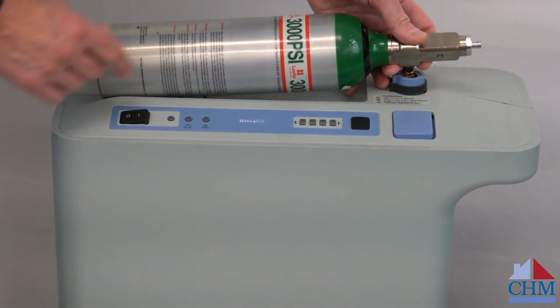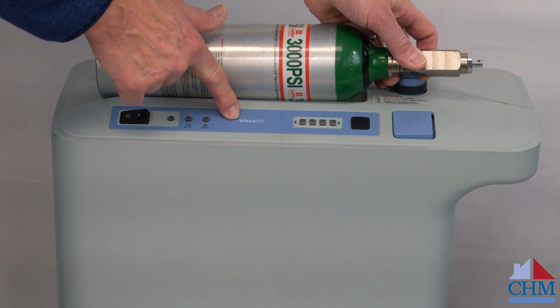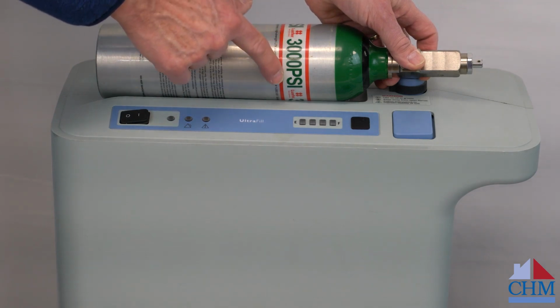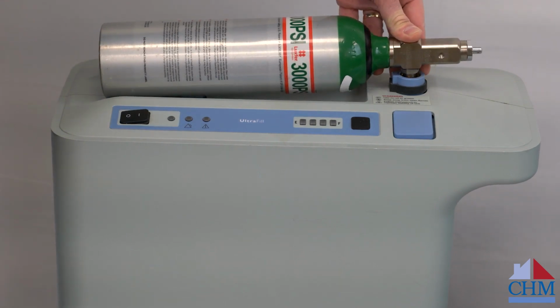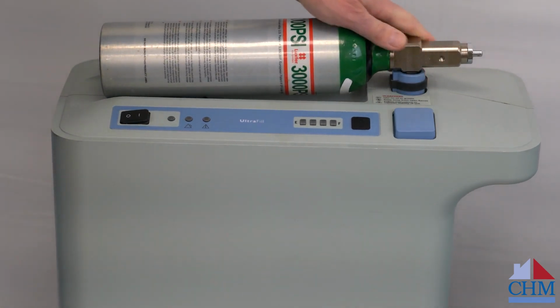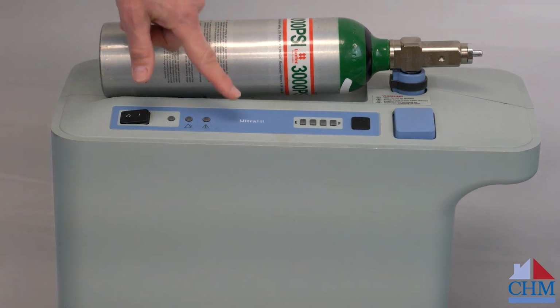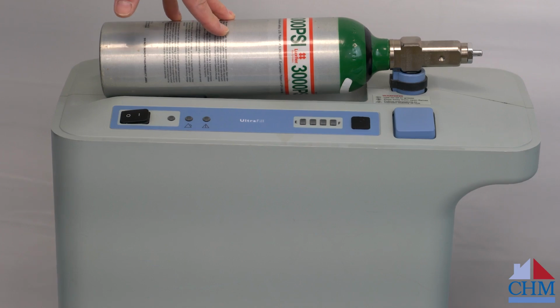You'll also notice here, the reason that this is called the Ultrafill is that this system fills tanks up to 3,000 psi. Typically, tanks are filled to 2,000 psi, so there's a third more oxygen content in the Ultrafill. So that's why it's called the Ultrafill, because it fills the tank to 3,000 psi.